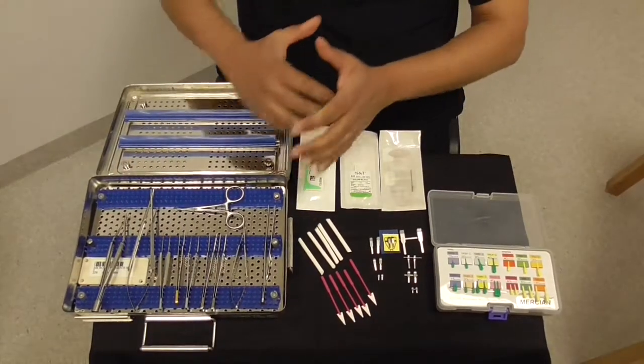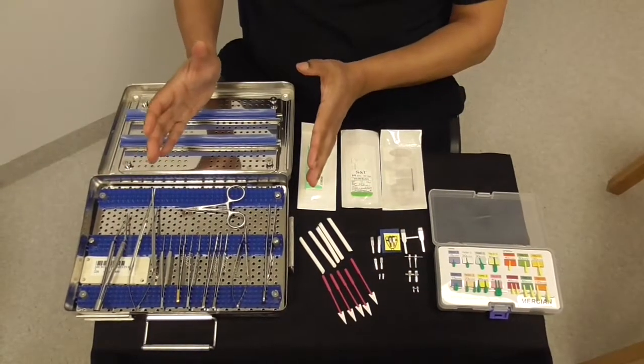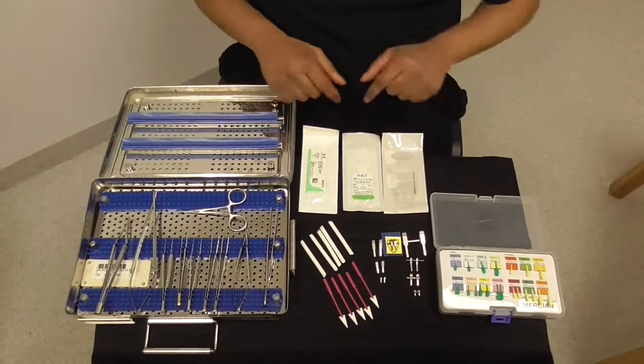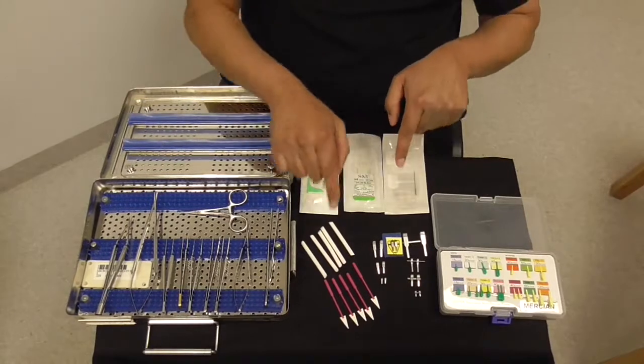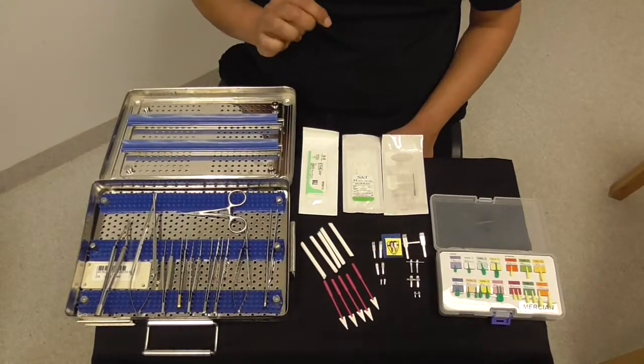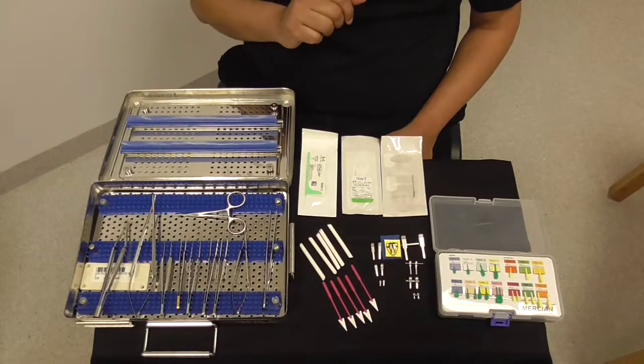The microsurgical kit involves the instrumentation here, a wide variety of clamps, sutures, and other bits and pieces that help with microsurgery. So we're going to first start off with the instruments.